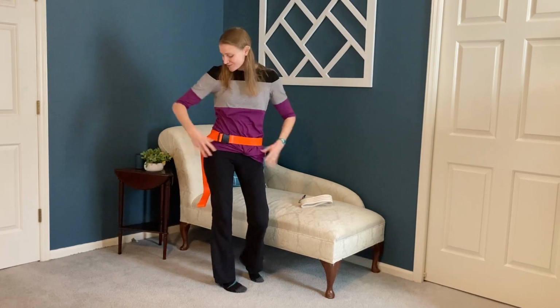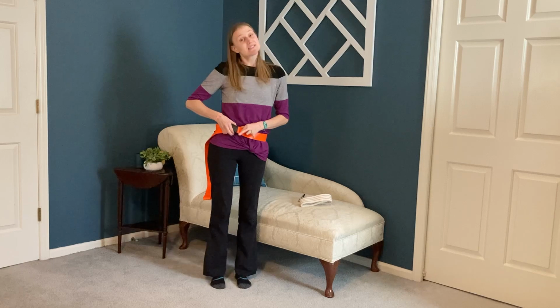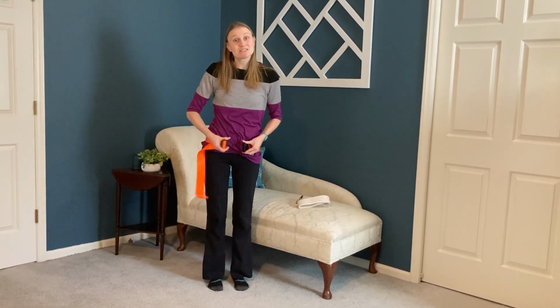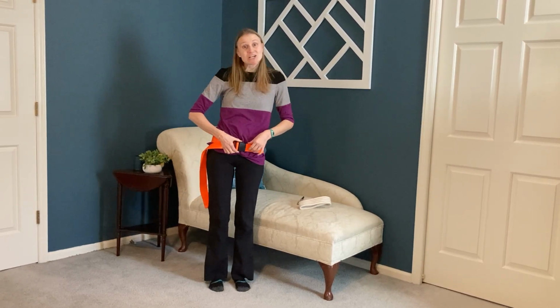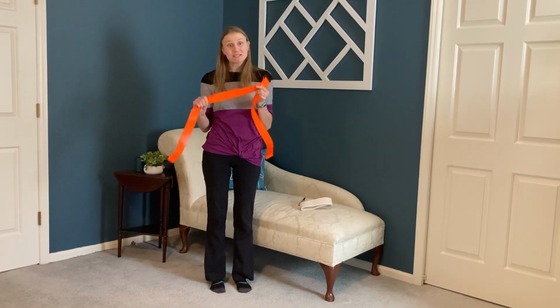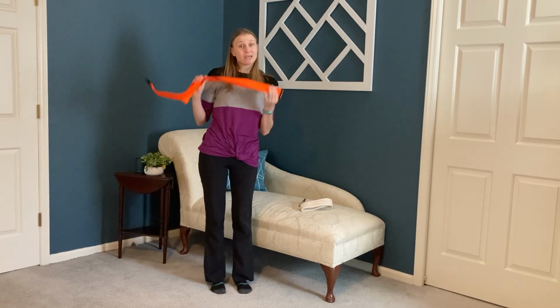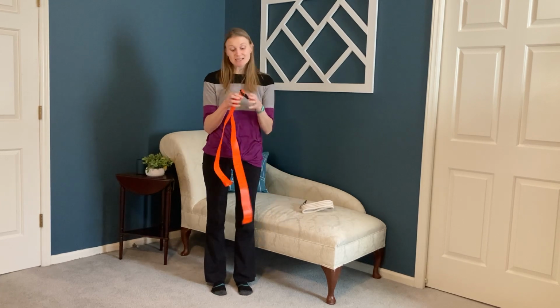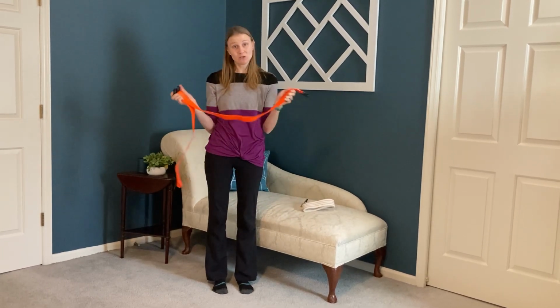So, concept of the gait belt: get that belt low and tight across the hips. There are a few different kinds. This is my personal preference of a gait belt. It buckles and opens and closes very easily. So if it's for a single client, it stays the same tightness. I actually don't have to adjust it. It's also made of vinyl, so I can clean it with a sanitary cloth. If I were in a facility, or, as I am in home care, use this on several different clients, I can clean it between patients. This is very easy to tighten with your adjustable strap. A quick release, buckle and unbuckle.